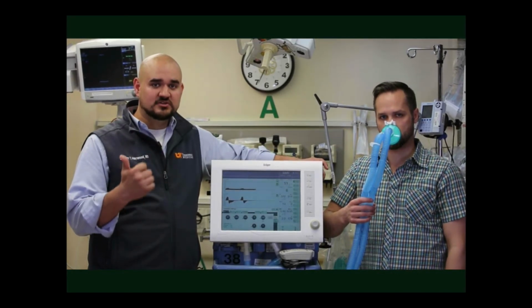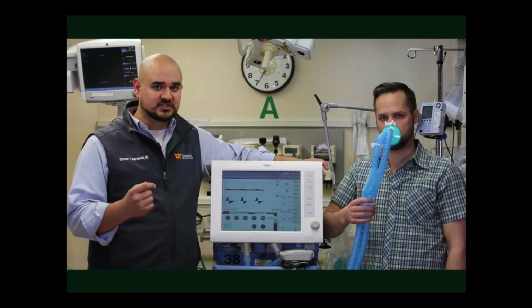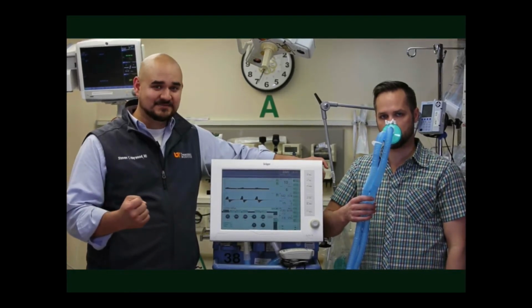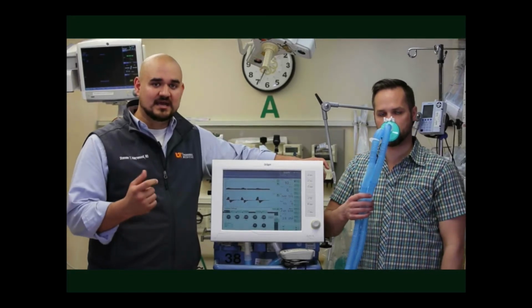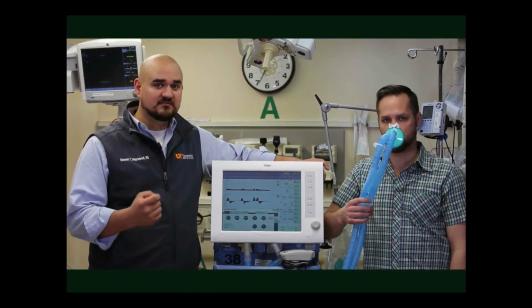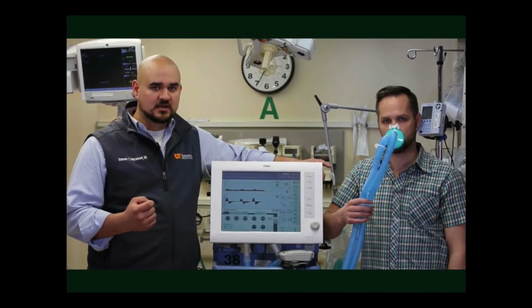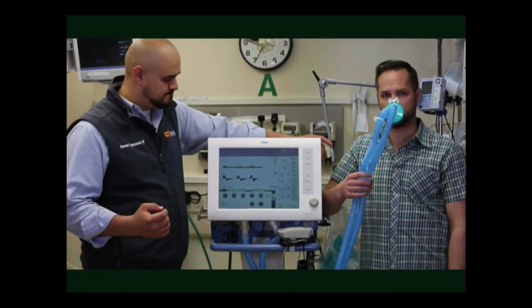You'll set your FiO2 and your PEEP, which we know control oxygenation. You're going to set a pressure support, which we know helps with spontaneous breaths. And you're going to set a rate and a tidal volume, which we know controls your minute ventilation, which will control how much carbon dioxide you remove from your patient. So now let's go to the vent and see what this looks like.